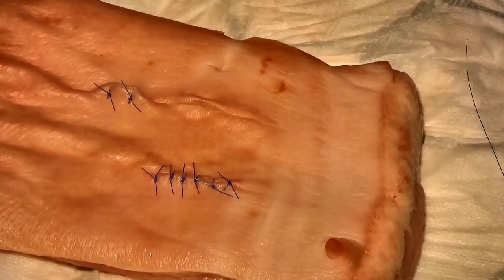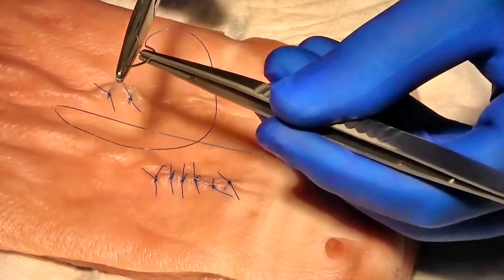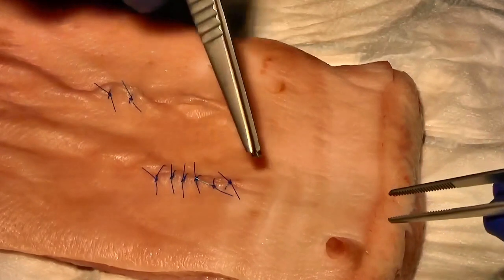Note the safe management of the needle. I covered the sharp end of the needle in the jaws of the needle holder, and therefore it can't do a needle stick injury.